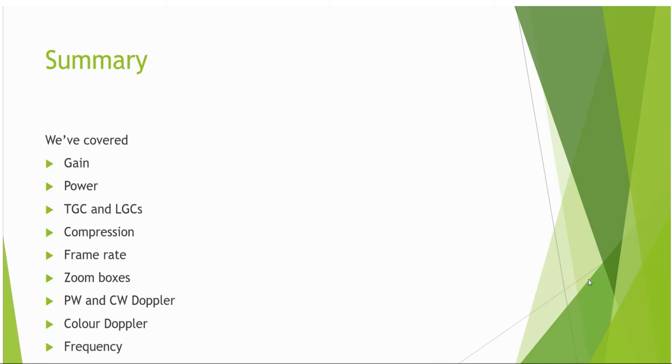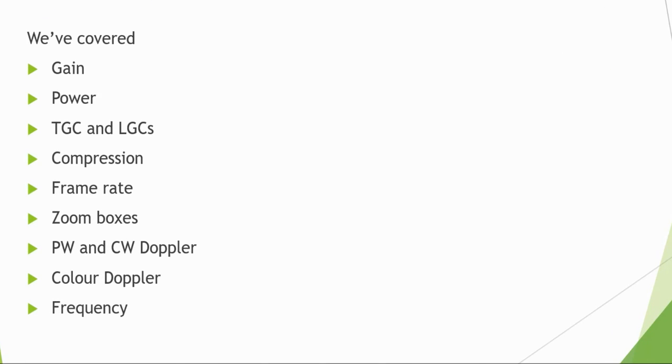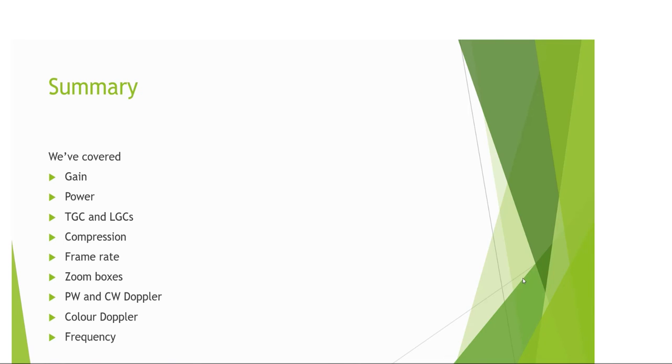In summary, we've covered many of the common machine settings in this lecture. What is the effect when the function is activated and adjusted, and how this is reflected on the displayed image? Importantly, we can assess how these settings can be best put to use to optimize our study and potentially any diagnostic findings. The one take-home message to remember is that most of these settings are not set and forget as part of the machine's presets.